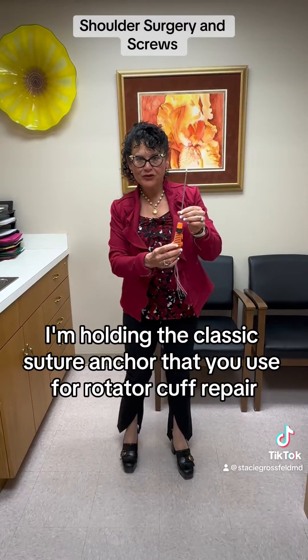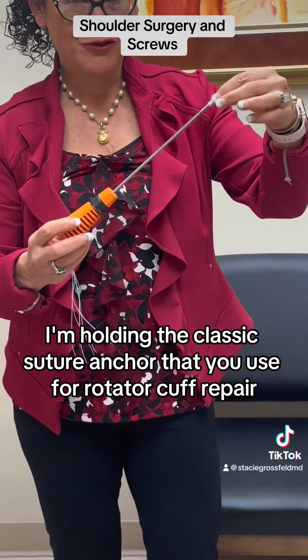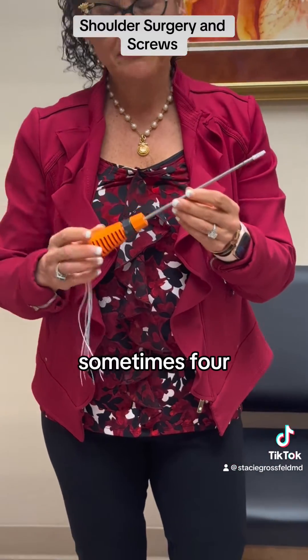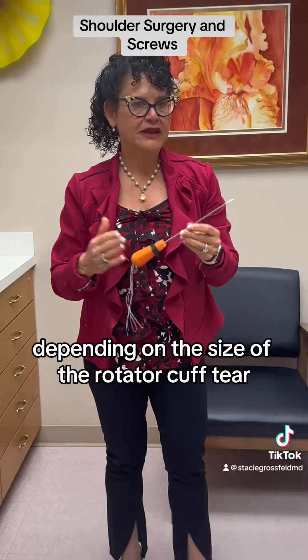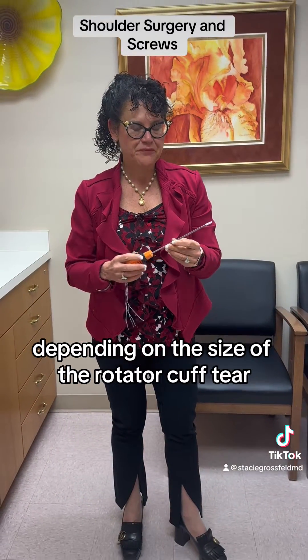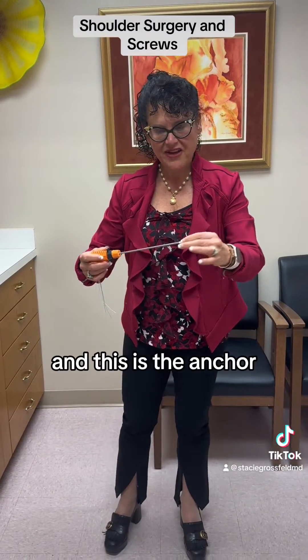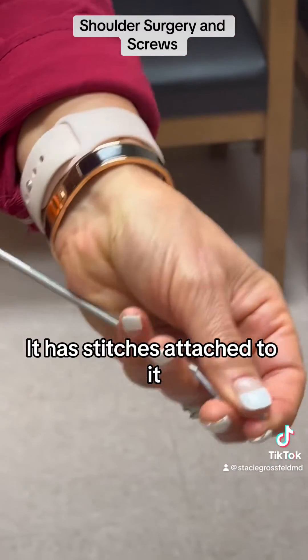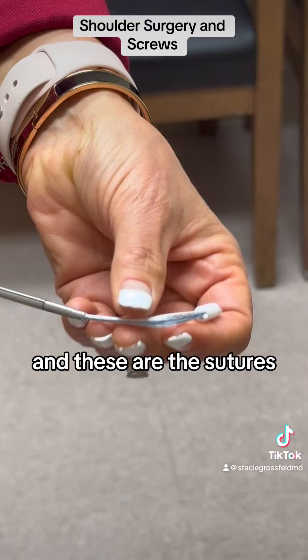Well, I'm holding the classic suture anchor that's used for rotator cuff repair. We typically will put three of these, sometimes four, in your shoulder, depending on the size of the rotator cuff tear. This is the anchor, and it has stitches attached to it — and these are the stitches.